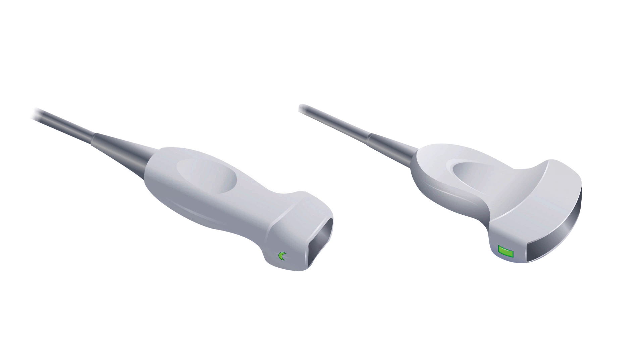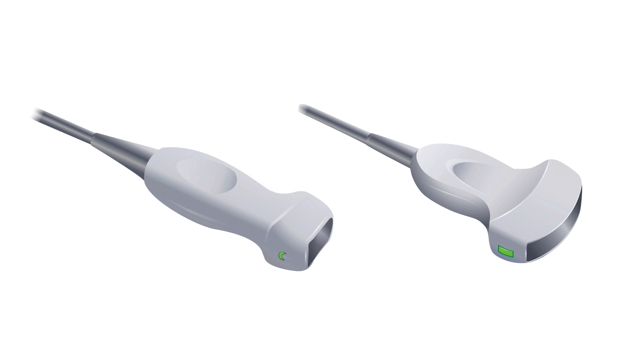We're going to scan the unaffected or non-painful side first to establish baseline depth and gain settings and to recognize the normal anatomy for that patient. Then we'll scan the affected side. We're going to obtain a sagittal and transverse view of the kidney on both sides, and a sagittal and transverse view of the bladder. We'll also be able to evaluate for the presence of ureteral jets when we look at the bladder.